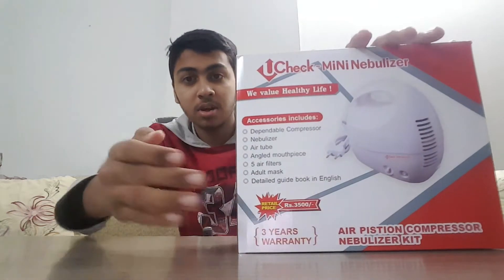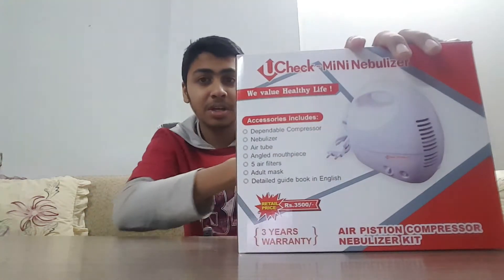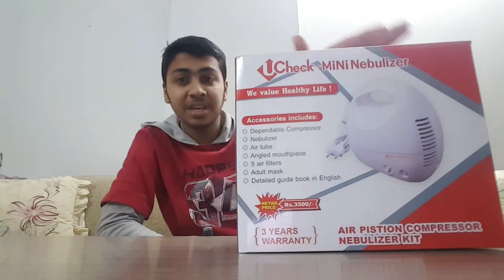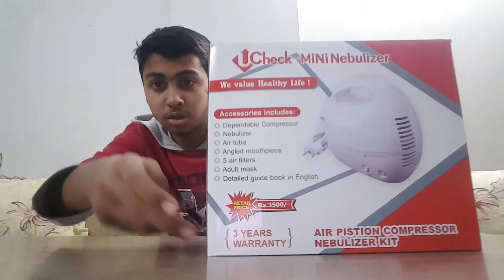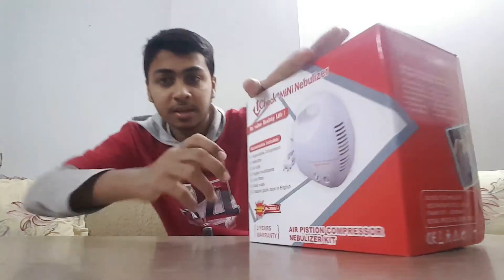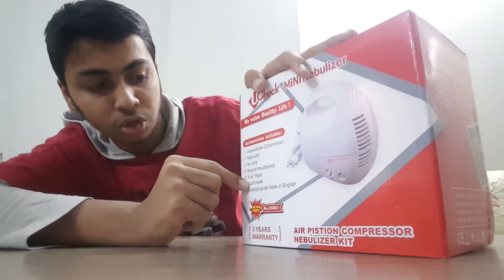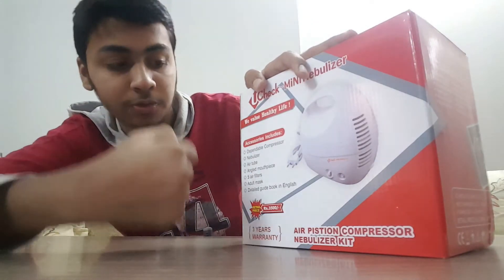On the first box you can see the nebulizer picture where it is written 'Check Nebulizer Mini'. It is a mini and portable nebulizer which also has a three-year warranty.